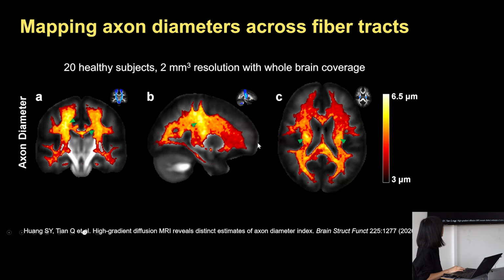I think that these frontal fibers are finer to subserve higher order processing functions, and we have larger fibers going back to the visual cortex, which is highly developed in humans. And so, armed with this tool, we were really interested in developing the axonal diameter marker into a potentially useful imaging biomarker for looking at potentially axonal degeneration in the brain.